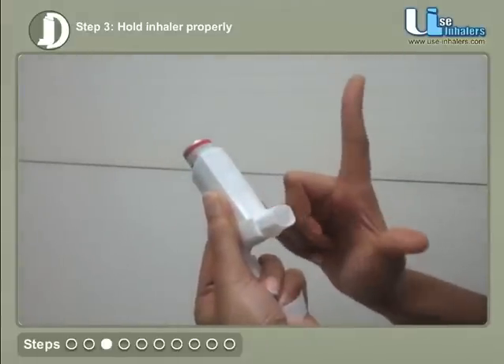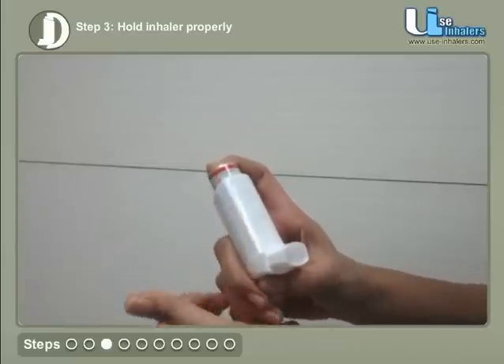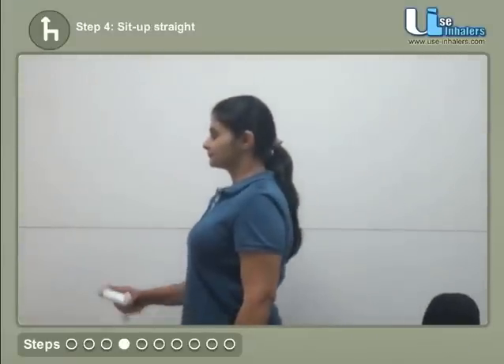Hold the inhaler firmly by placing your index finger on top of the canister and thumb on the bottom of the mouthpiece. Sit up straight or stand up.